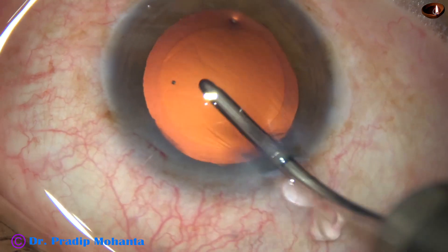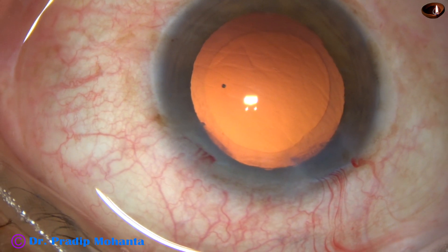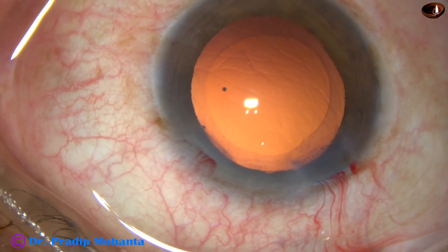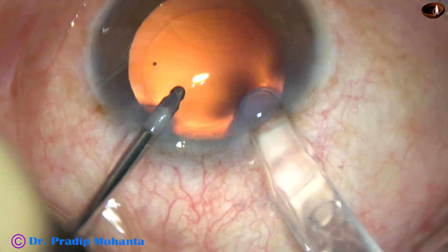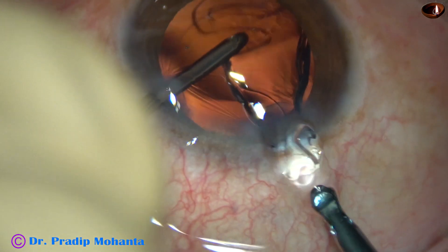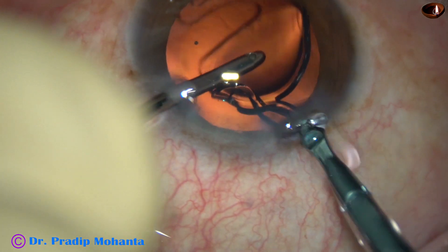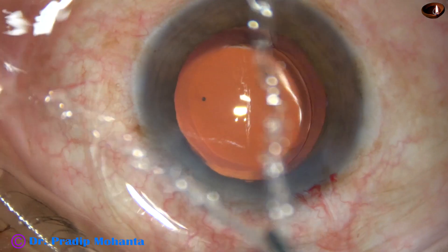And now, see the direct chop. The tip of the FACO handpiece goes into the anterior chamber with its bevel down — that is, the bevel is towards the lens mass. I am in FACO 2 mode from the very beginning, where the vacuum is about 400 in this case and the flow rate is 40 ml per minute.